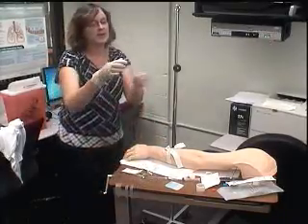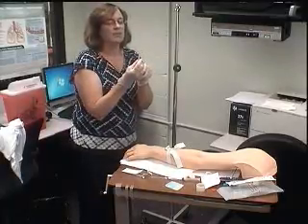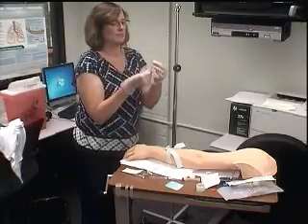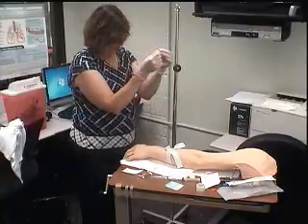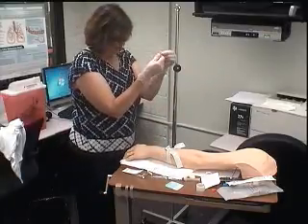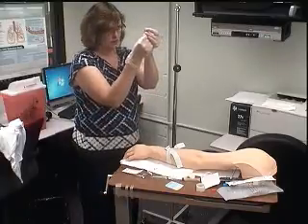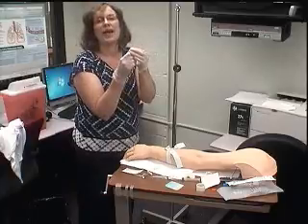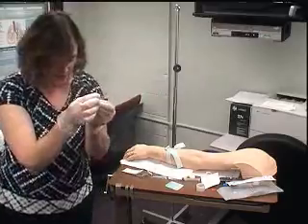I want to get my needle and take the cap off. Now some people say these stick a little bit. If you're worried about that, you just loosen it up a little bit, but please don't loosen it all the way up and then try to rethread it. That is what causes problems with the catheter breaking. Do not do that.